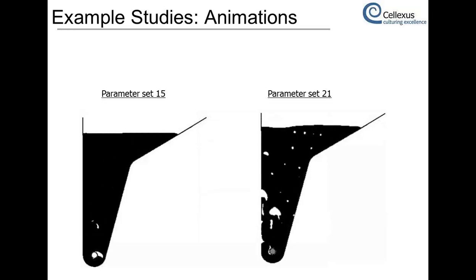We did some modeling, and we did some correlations to the high-speed physical tests. And here's 2 sets of data that we did some comparisons to. Data set 1 and the model 1, and data set 2 and model 2. And as you can see, in data set 1 we get a bit of a divergent response. In data set 2 we get a better or very close correlation. However, we were very happy with the response over several sets of data, that we were quite confident that the model was predicting the physical response quite accurately.